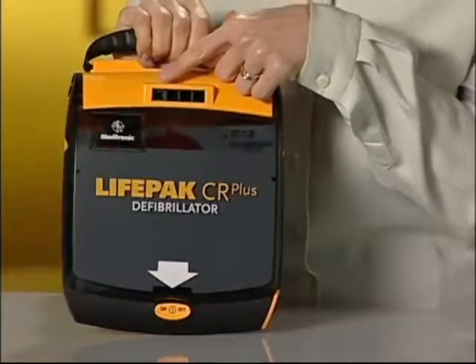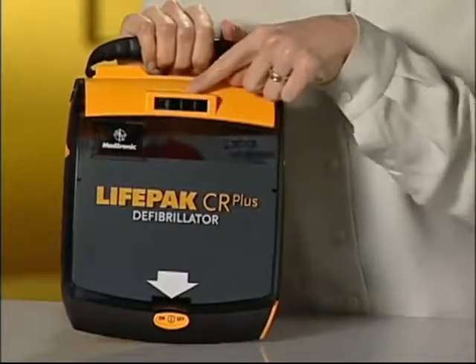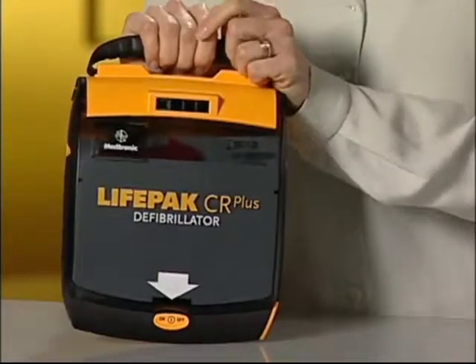The Lifepak AED is easy to maintain. It does its own self-test at regular intervals to be sure it's ready. If it senses anything you should know about, it will change the OK symbol, here, to another symbol. You should check this display periodically to make sure it says OK. If you see another symbol instead of OK, look it up in the manual to see what it means and what you should do about it.